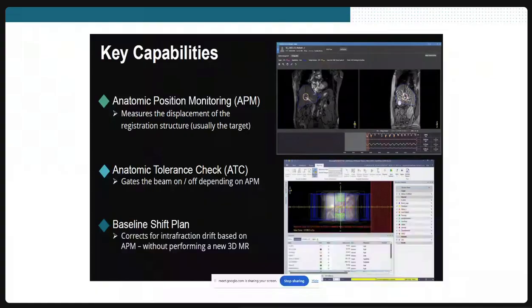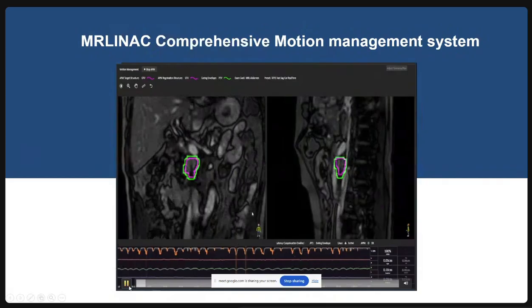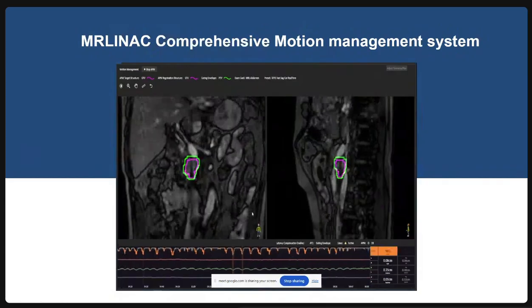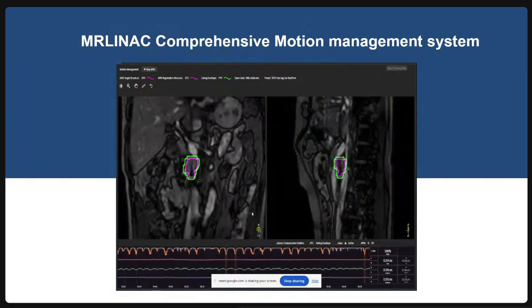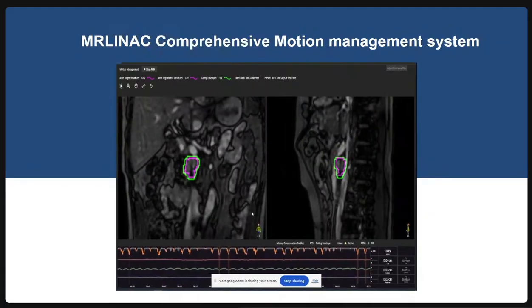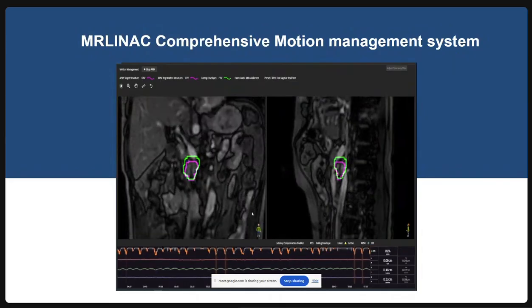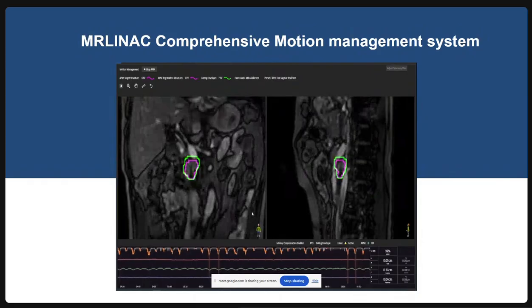This is quite amazing, because this is a typical case where I do an SBRT treatment, where we can see that the patient is holding the breath, and then now this patient started breathing. When he started breathing, the system holds, an orange line comes, which means the beam is off. Whenever the tumor comes within that particular area of the green line, the system delivers the dose. So that's amazing. This is the quality of treatment we do in our own patient.